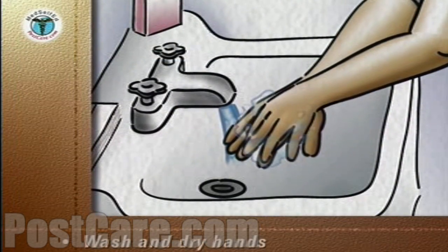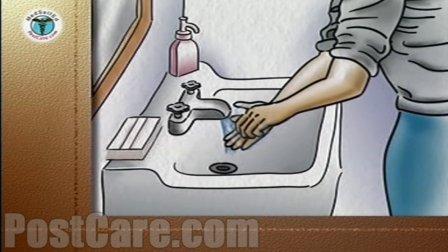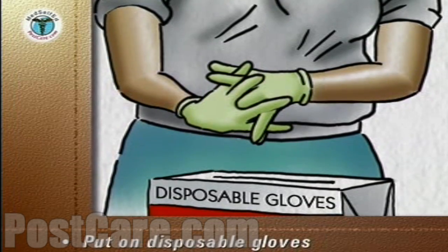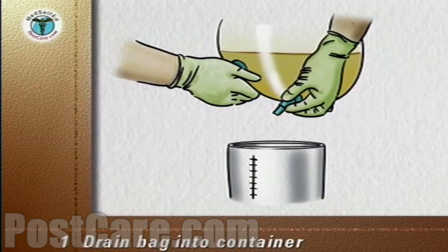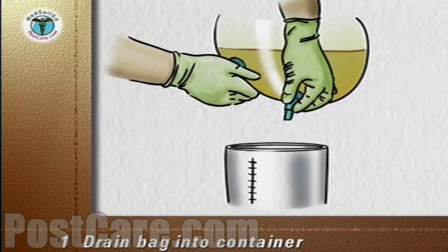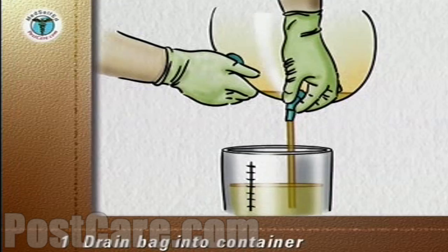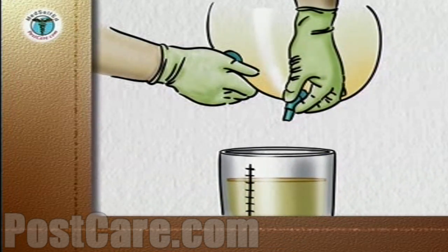Carefully wash your hands and dry them with a paper towel. Discard the paper towel into a waste basket. Put on disposable gloves. Place the container under the drainage bag. Remove the drain from its holder, point it into the container, and release the clamp on the drain to allow the urine to flow into the container. Do not allow the drain to touch the container or anything else.